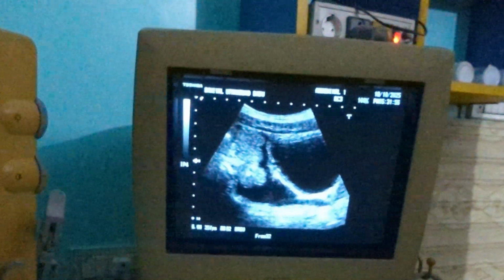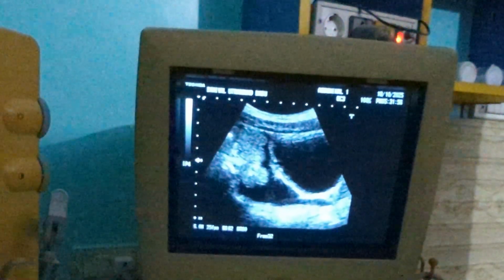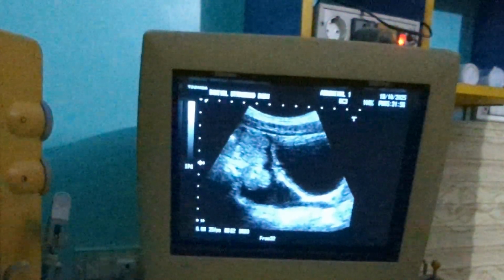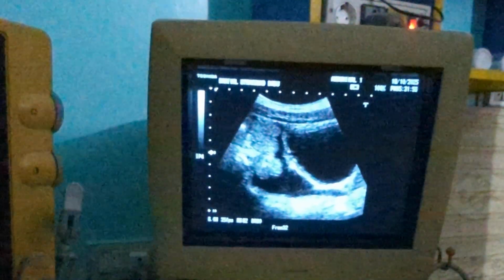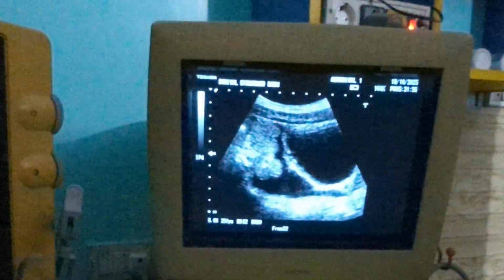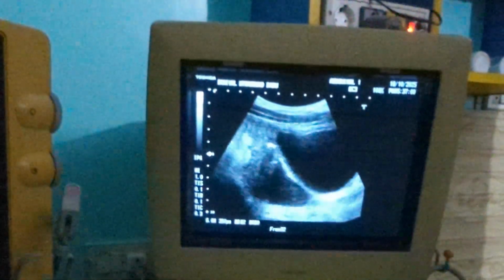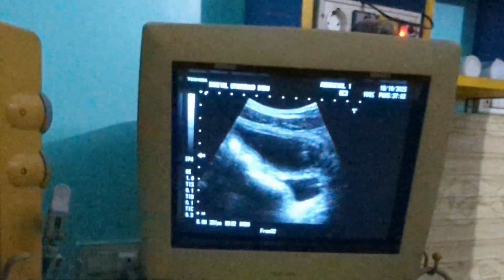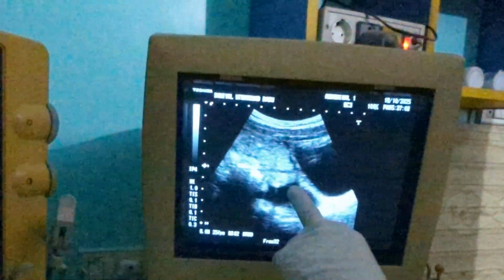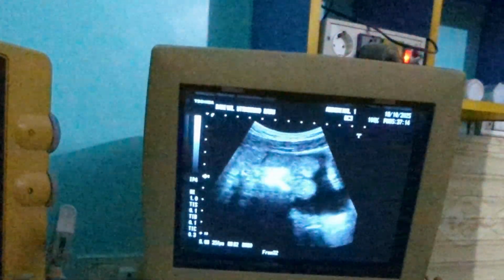Fluid may appear echogenic with fine internal echoes, and may be from ovarian, gastric, or colonic cancers, which may cause malignant ascites. The fifth big variety is chylous or lymphatic causes, like lymphoma, tuberculosis, or postoperative lymphatic leak, or chylous milky fluid. So this was all I wanted to tell you. Now the real time shows us a hypoechoic space around the distended bowel loops. These bowel loops are distended, though they are normal.